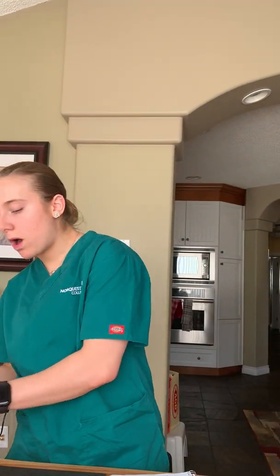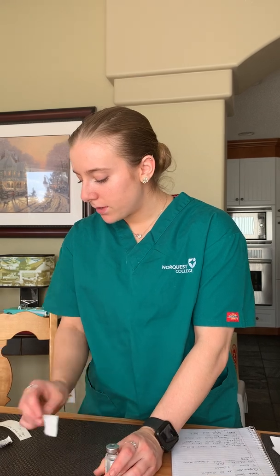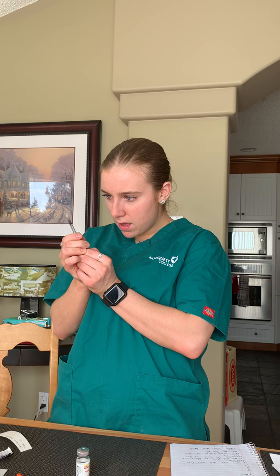After my first check is done, I will now prepare my medication. So I will take my alcohol swab. I will swab the top here, ensuring that it is clean. I will then take my insulin needle and I will rainbow it open. Perfect. We are going to be giving 0.12 ml today, so 10, 11, 12.